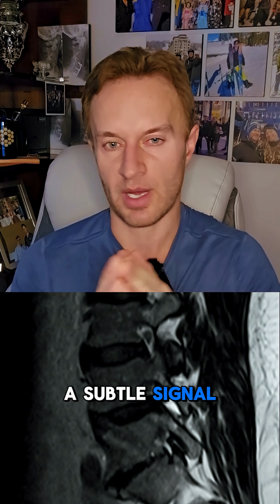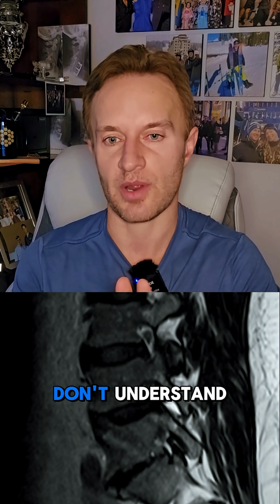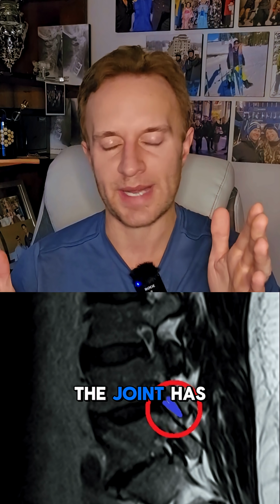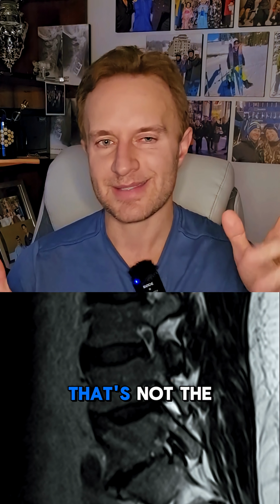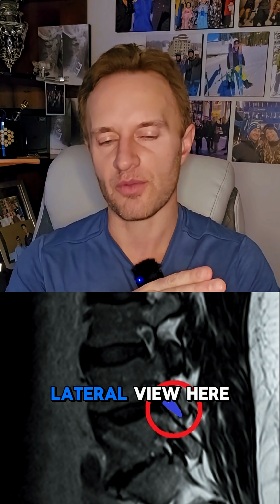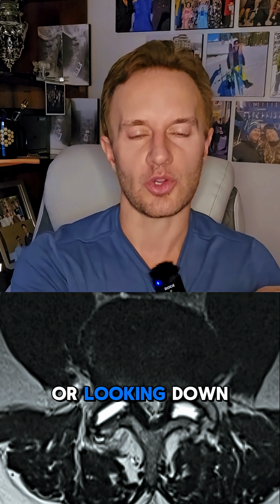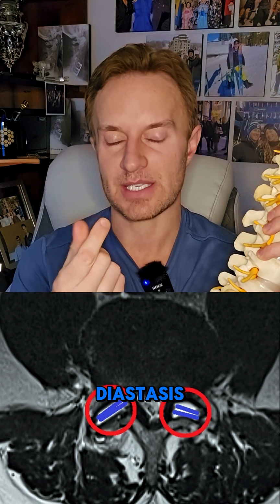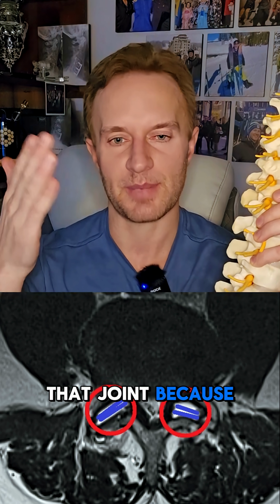Here's a subtle signal on an MRI scan that most radiologists don't understand. Most radiologists will say that this is an inflammatory condition, that the joint has fluid in it because it's inflamed. That's not the case. It's because the joint itself is actually spread wide open. So on the lateral view here and on the axial view, or looking down the pipe of the spine, you can see that there's what we call facet diastasis, or liquid in that joint because of instability.